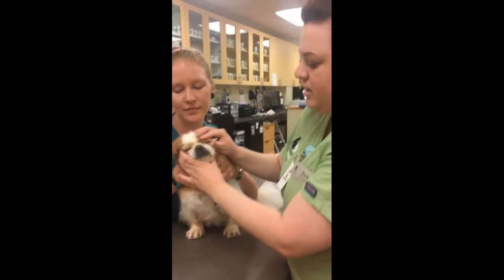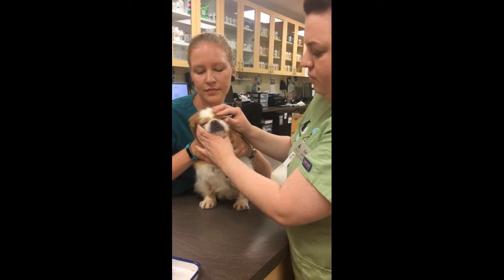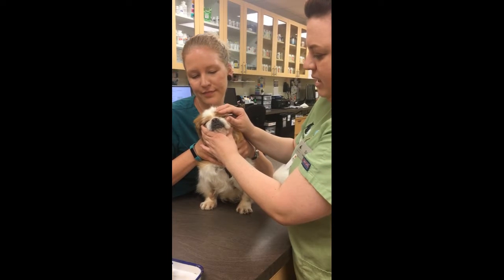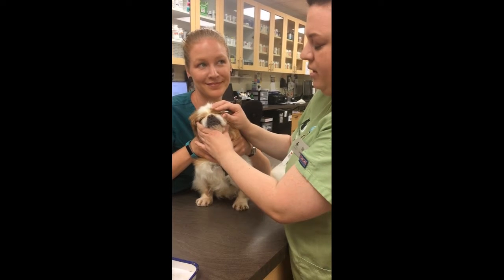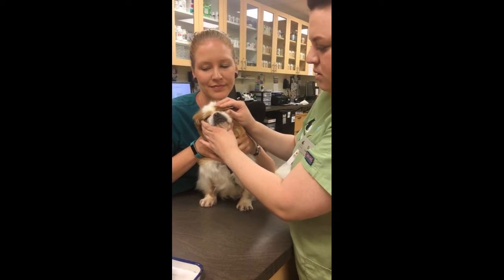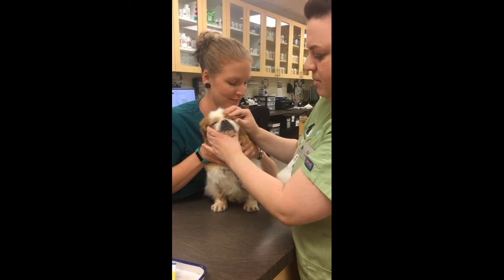What this does is it tells us how much tears the eye is producing. It'll tell us if the eyes are dry, if they're producing enough, if they're normal — just by reading the notches on the strip.